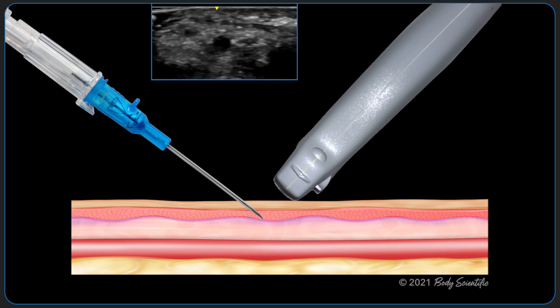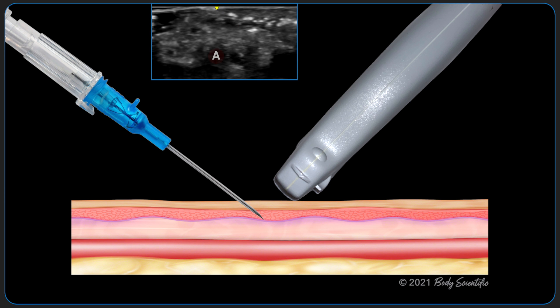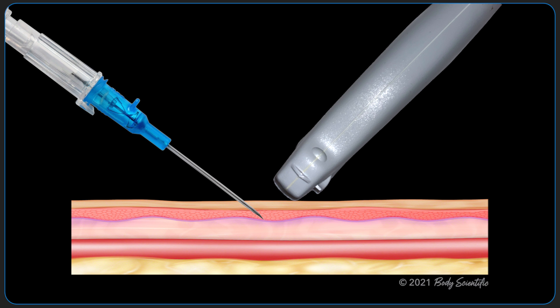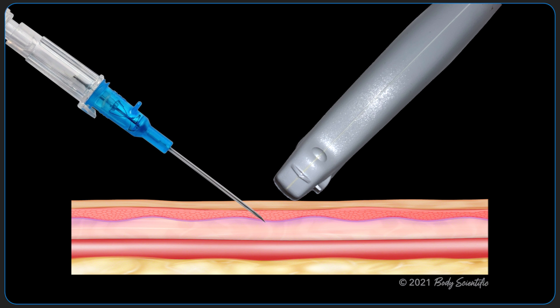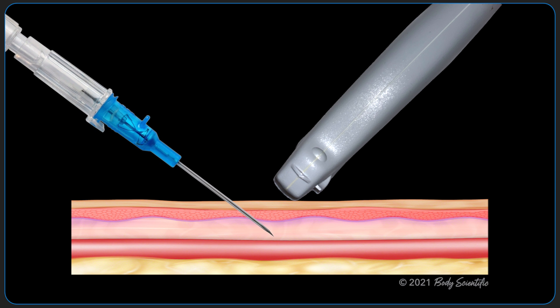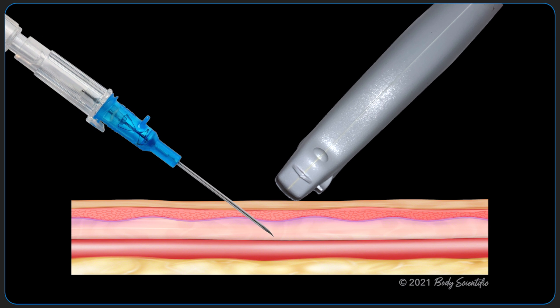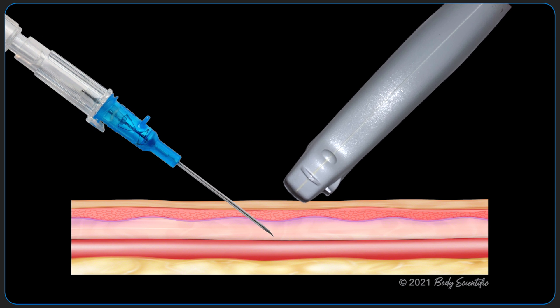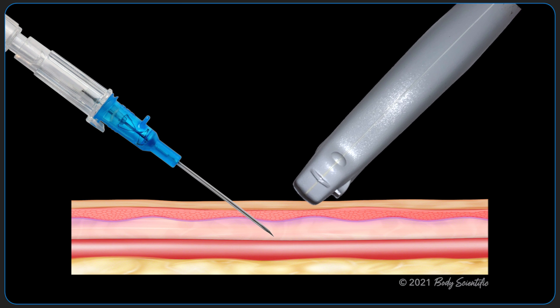In the ultrasound image seen here, the bevel is seen off center from the vessel and adjustments of the angiocath are therefore necessary. As the needle is advanced, the ultrasound transducer is translated at a similar angle to continue to visualize the bevel.